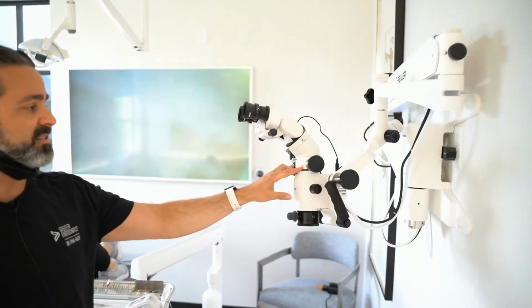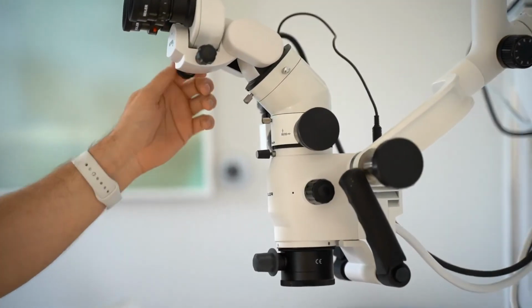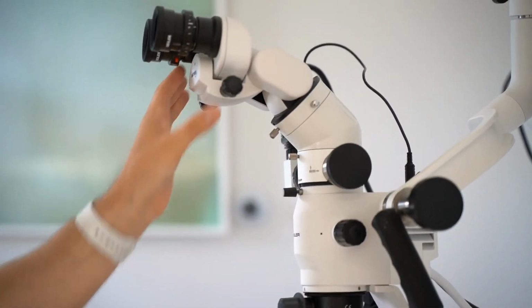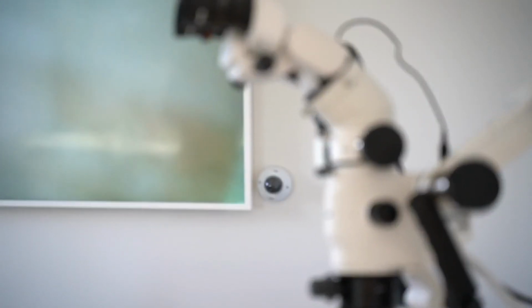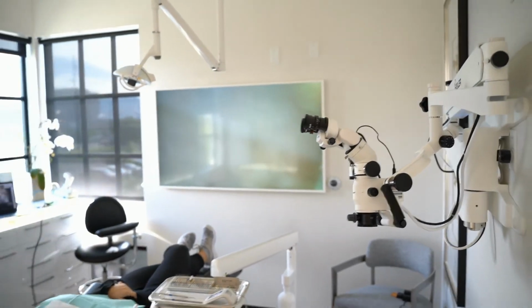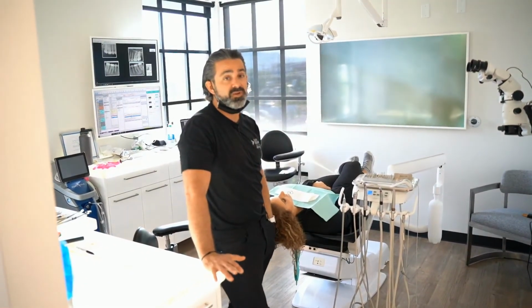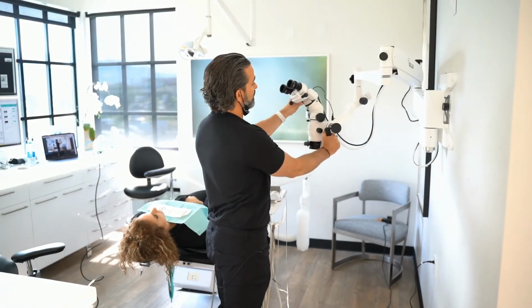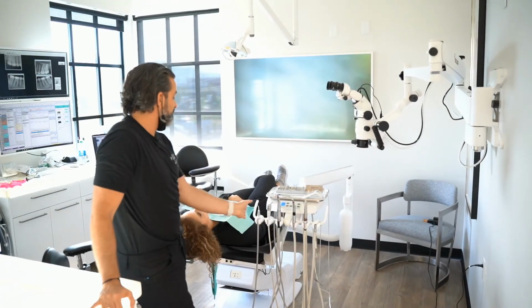Like I said, this Seiler's beam splitter was a huge selling point to me. I'm not afraid to turn things upside down. That was important because I liked my shoulders not bench pressing or military pressing, and once I was able to flip that around, the scope became very comfortable for me. I think we all drive in our driver's seat in a car differently, how we posture our seats. I think you'll find that the more features you have to dial things in, the happier you'll be. So picking a company like Seiler that gives you a ton of configurations actually makes a difference. I think in the general dentist space, this ability to cant your oculars is really important if you work off center, off a patient's head.